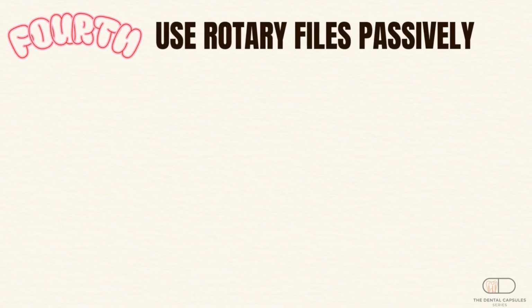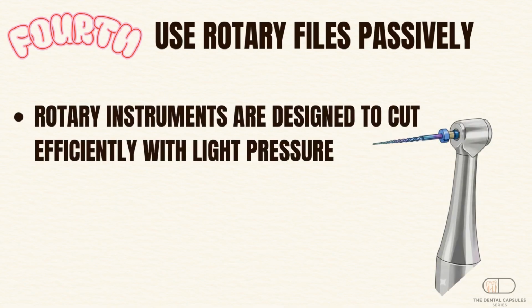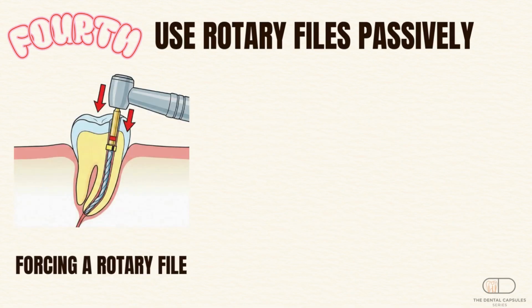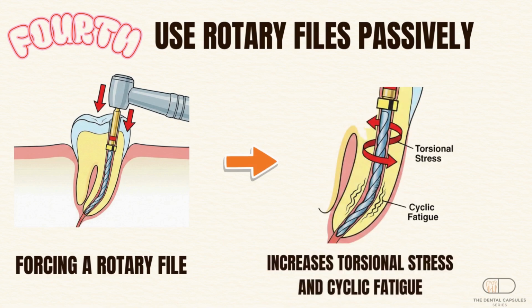Fourth, use rotary files passively. Never force them. Rotary instruments are designed to cut efficiently with light pressure, not with pushing or aggressive force. Forcing a rotary file increases torsional stress and cyclic fatigue, which greatly raises the risk of file separation.